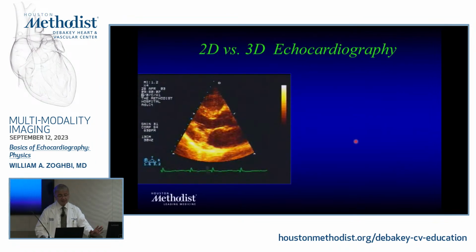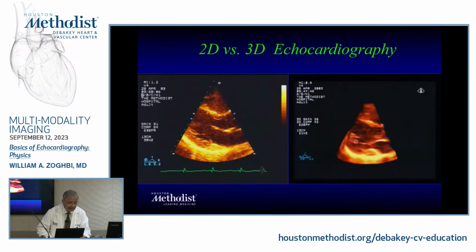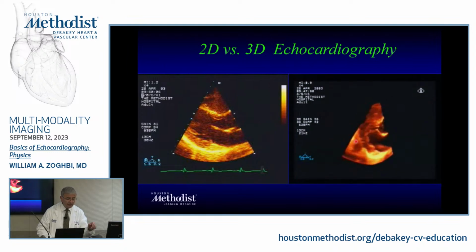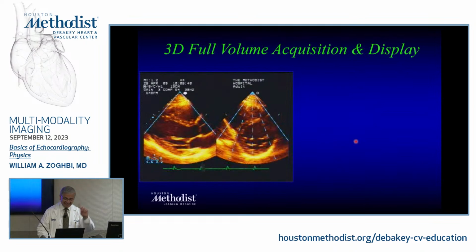3D has the same principle, but instead of just one single plane, multiple planes nowadays. These are actually from among the first 3D that we've done here, and I left it just for historical reason, April 25, 2003, 20 years ago. And you could see that a volunteer, actually a cardiology fellow, who is a leader in the field of echocardiography, not to be named. Not in this room.